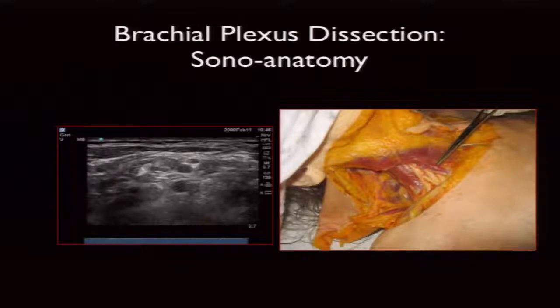Zooming in closer, some fascia covers the brachial plexus. As we take the fascia off we get a better impression of the two scalene muscles — anterior and middle — sitting either side of the nerve roots. We can see three circles lined up like traffic lights in the middle of the image, but be careful: those are C5 and C6, not C5, C6 and C7. Some older articles have actually labelled these incorrectly, so be aware when reviewing the literature.